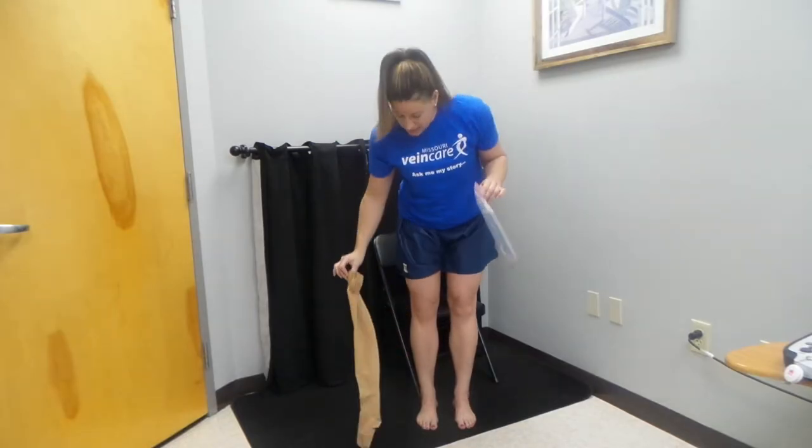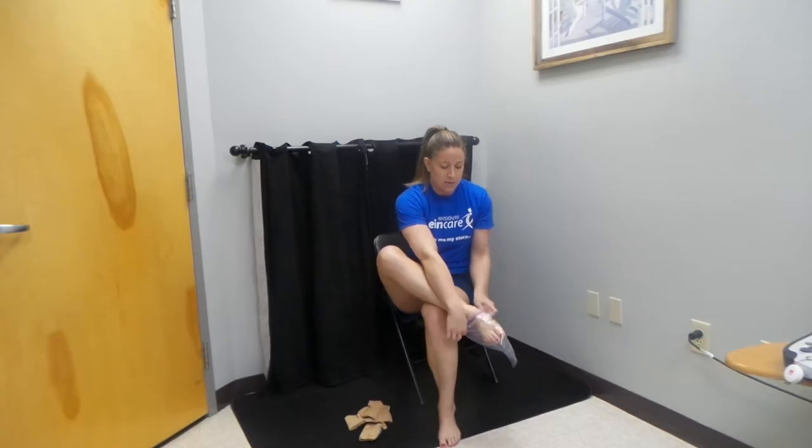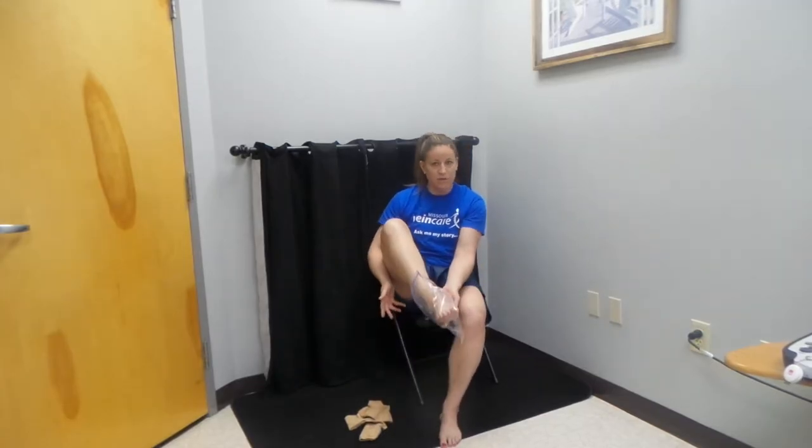The bag needs to be big enough to where it can actually go over the foot, over the heel and up to the ankle. So I'm going to slide the bag on — it doesn't matter what kind it is, just make sure that it can cover the foot.